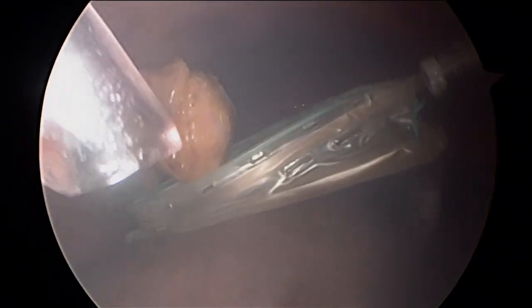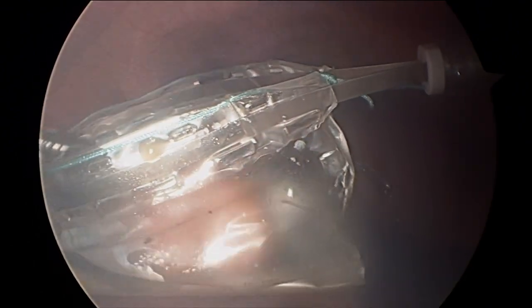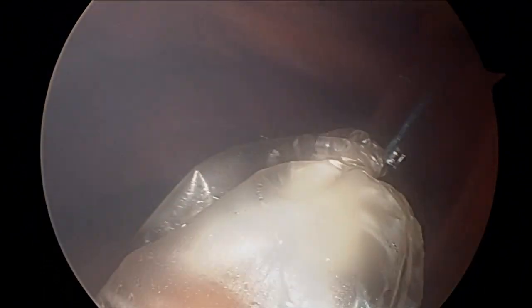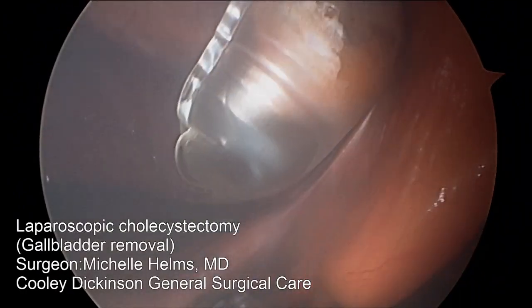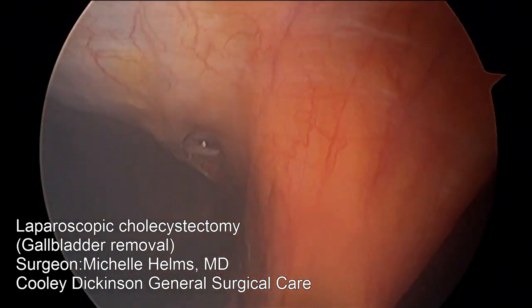Now we introduce a ziplock bag called an endo pouch. We put the gallbladder inside the pouch and cinch the pouch closed. Then we bring it out through a porthole — one of those four tiny incisions that make it a minimally invasive surgery. And we pop it through the belly wall, and no more gallbladder.